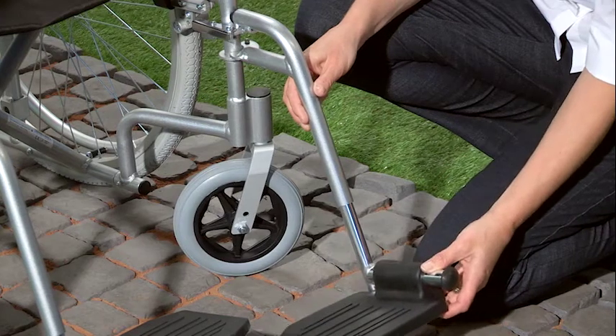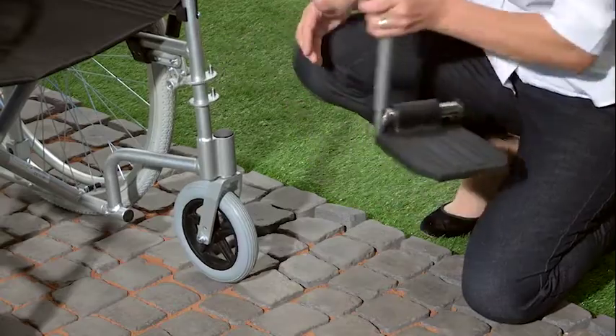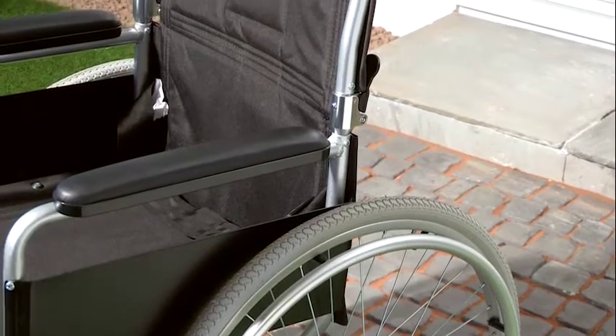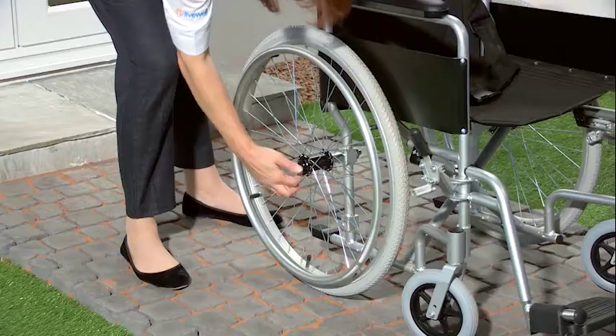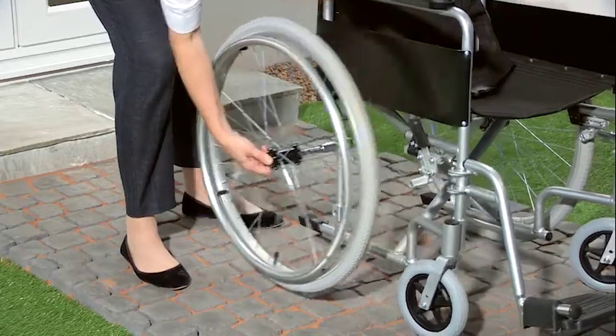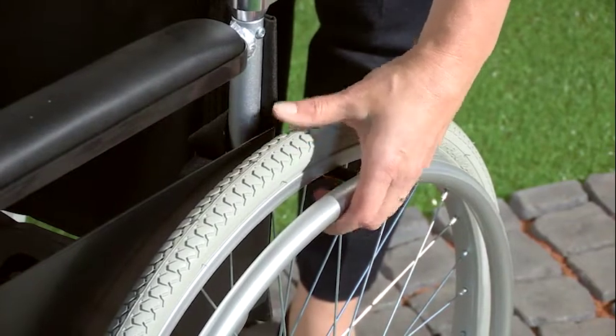The footrests are also height adjustable for comfort and can be easily removed for storage and transportation. This durable yet lightweight aluminium chair has a silver finish and is fitted with 24-inch quick-release rear wheels that have pneumatic tyres for a more comfortable ride.